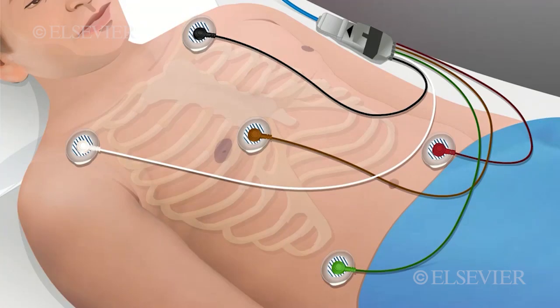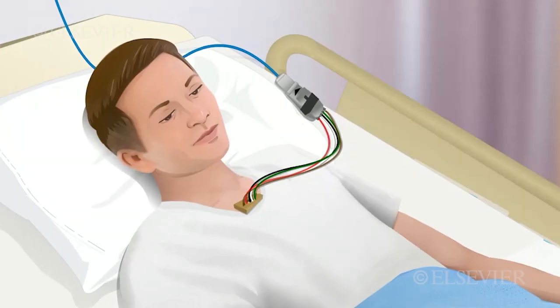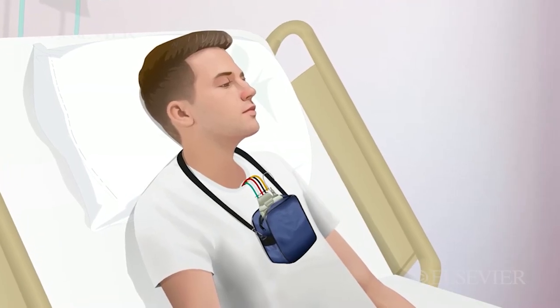Reduce tension on the lead wires and cables. For hard wire monitoring, fasten the lead wire and patient cable to the patient's gown, making a stress loop. For telemetry monitoring, secure the transmitter in a pouch or pocket in the patient's gown.